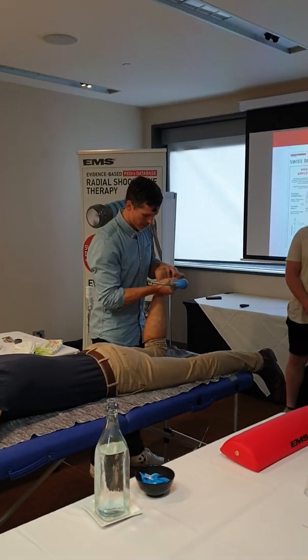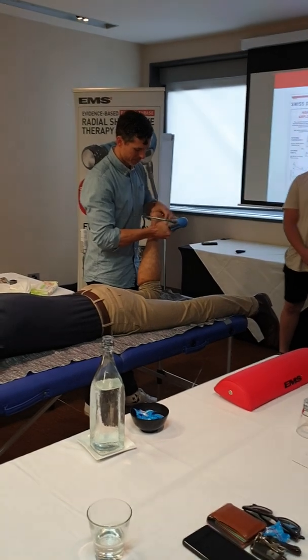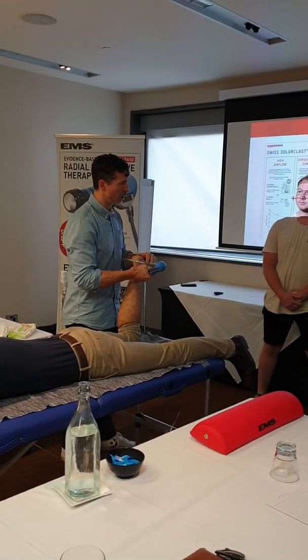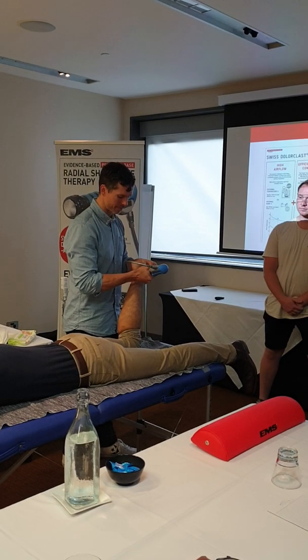It's like anything, use it over and over, it might get a bit loose. So just a good hand tight before treatment, make sure. I once had someone call me about this. Make sure you wipe it. Make sure you get the gel off. The gel accumulates a little bit and gets it gunked up.